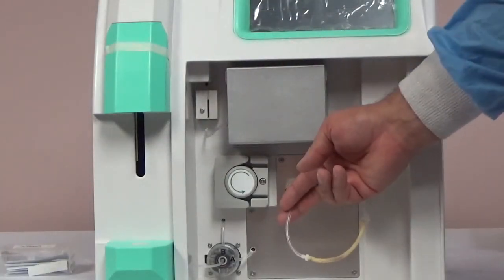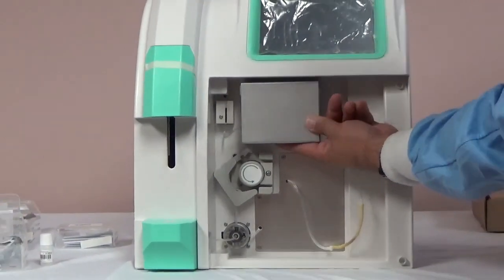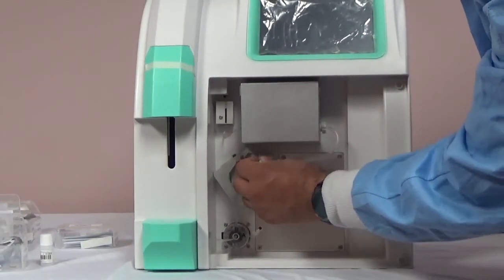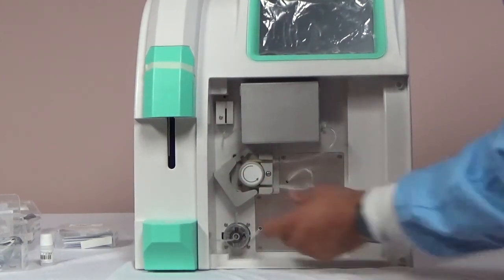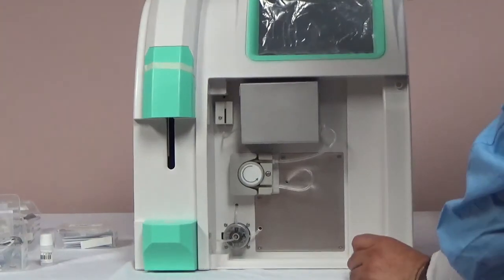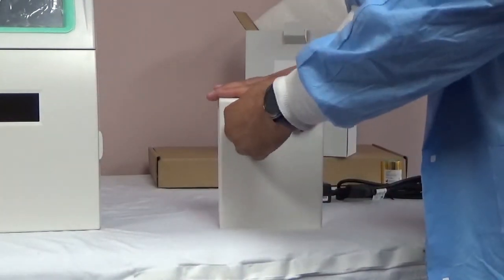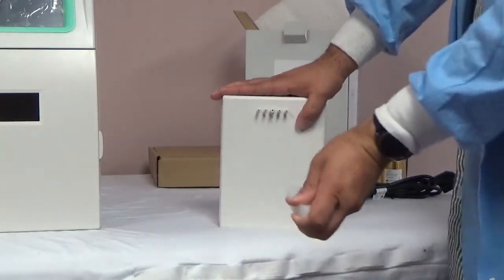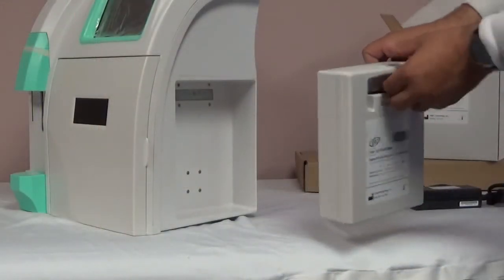Secure the pump tubing and peristaltic pump by unclipping the pump lock and stretching the tubing around the pump, then re-lock the clip. The reagent pack can be installed in the slot on the side of the analyzer. Remove the pack from the box and remove the rubber piece on the back. Slide it into place, pushing gently to secure it.